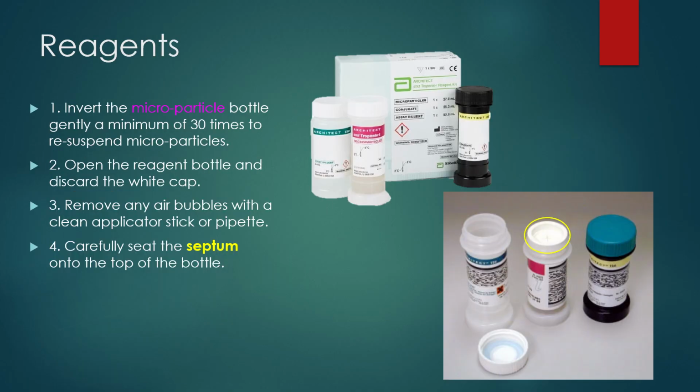Before placing the reagent bottles onto the analyzer, we have to prep them. The microparticle bottle, which has the lavender/pink band around it, must be inverted 30 times to resuspend the microparticle dot that is located at the bottom of the bottle, which can be seen once one inverts the bottle.